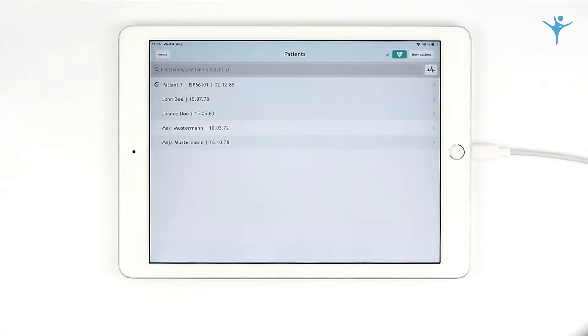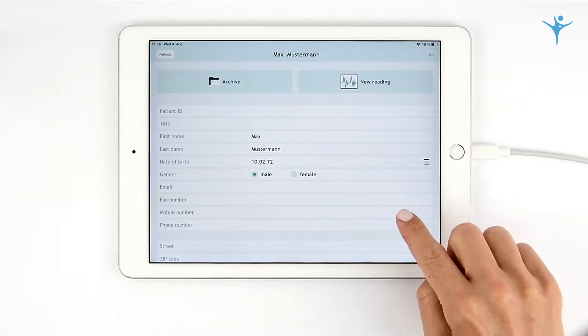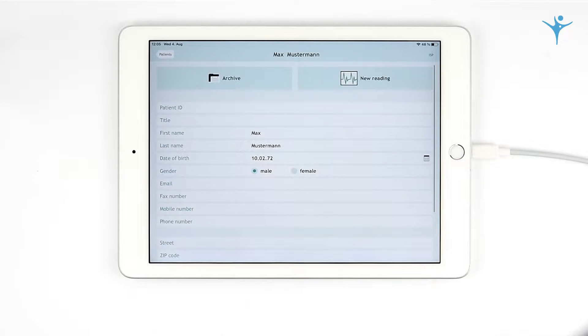Cardio Secure Pro, the high-end mobile ECG for iOS devices. Manage your patient's data and perform new readings.